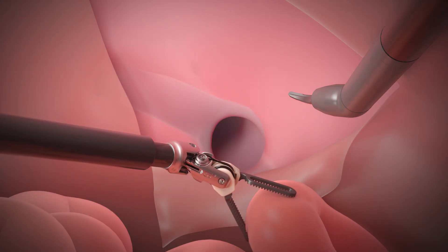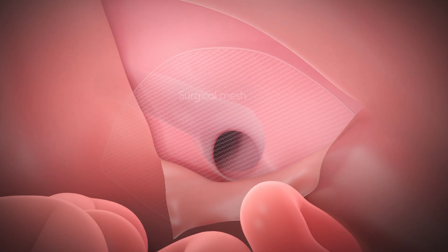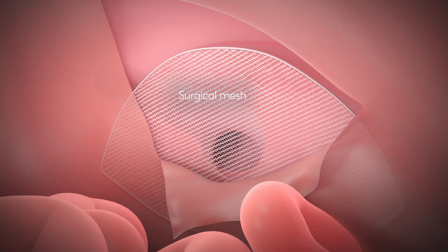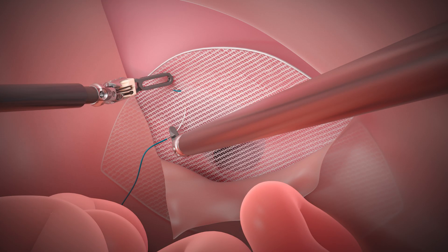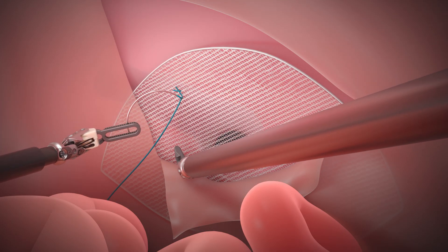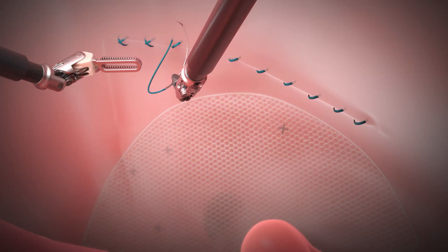Your surgeon puts the tissue back where it belongs. Surgeons typically use a special mesh to cover the hernia site. This will provide extra support to make the repair stronger, and it also helps prevent the hernia from coming back. Once the mesh is in place, the surgeon will close the tissue flap.